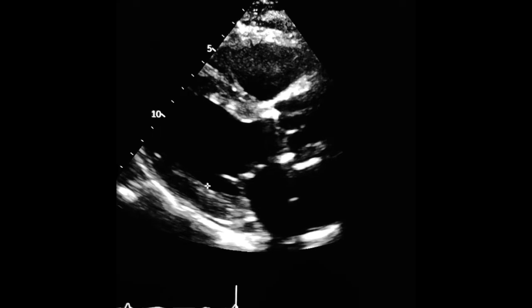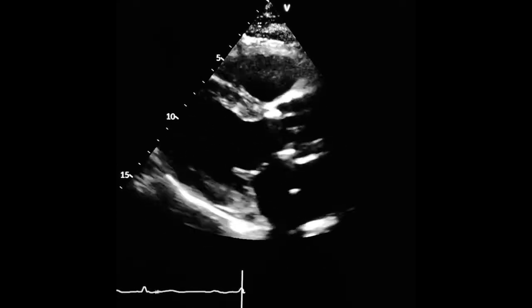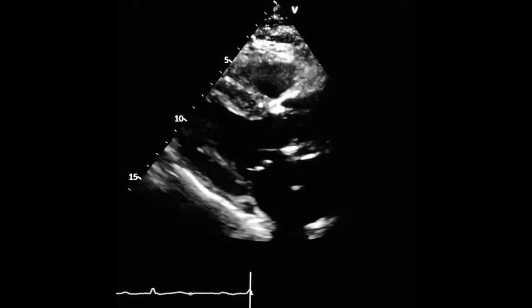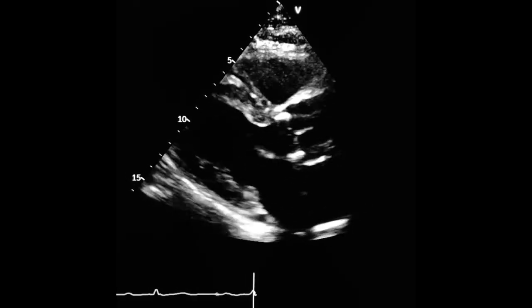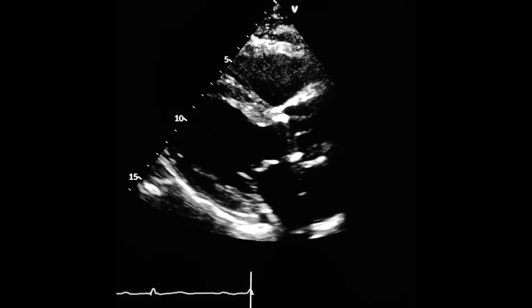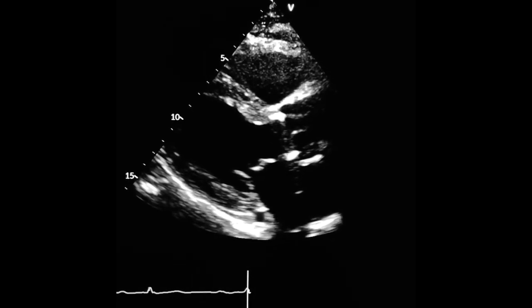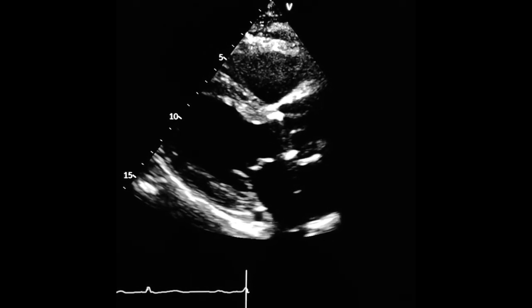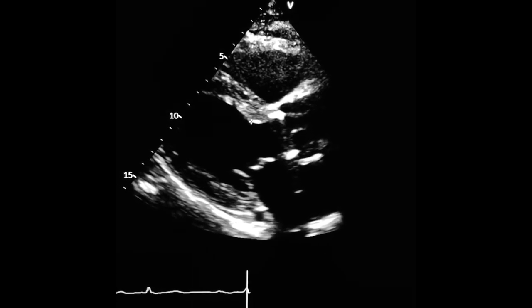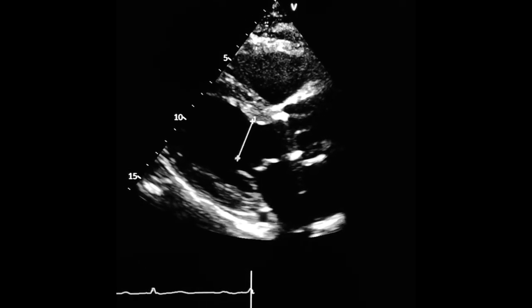First, I'm going to show you how to measure the diastolic diameter. Get your parasternal long axis view and freeze the image at the end of diastole. Now you're ready to measure the diastolic diameter at the base of the heart, from the septal endocardial border to the posterior wall endocardial border.